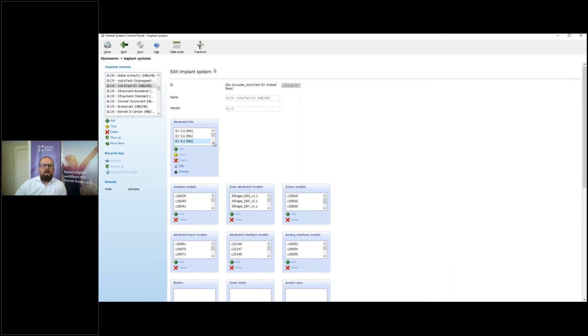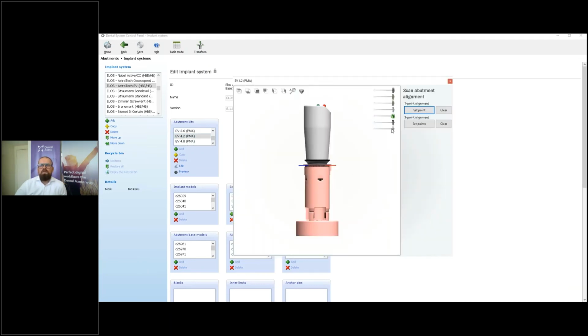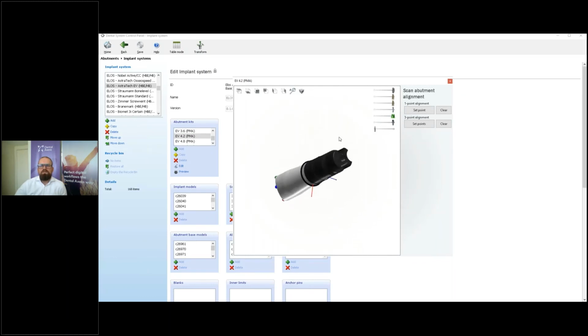I'm here in the model analog. That's the older version. Here we see the print model analog. If I go into that one, then we see the newer version. We see that over here. I hope it's all possible to see. And the scan body, so we know how to reposition another type of scan body.